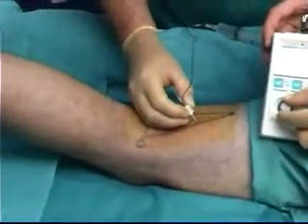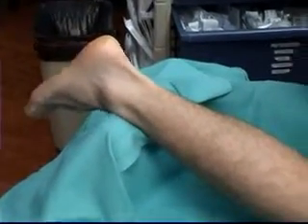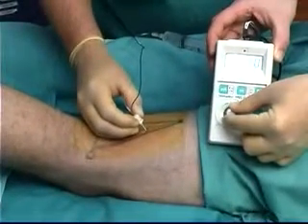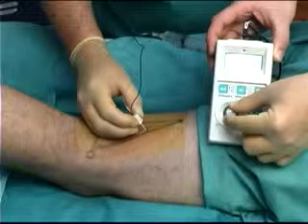Brisk plantar flexion twitches of the foot indicate that the tibial component of the sciatic nerve is being stimulated. The current of the nerve stimulator is turned down until brisk twitches can still be observed at a nerve stimulator output of 0.3 to 0.5 milliamps. If the muscle twitches are still brisk at less than 0.2 milliamps, it probably indicates intraneural needle placement, and the needle should probably be withdrawn slightly.